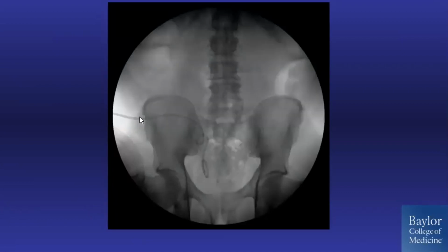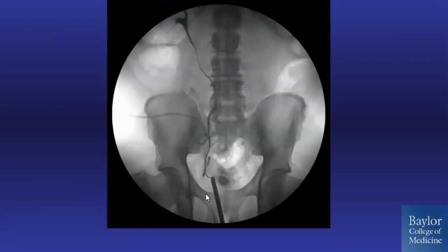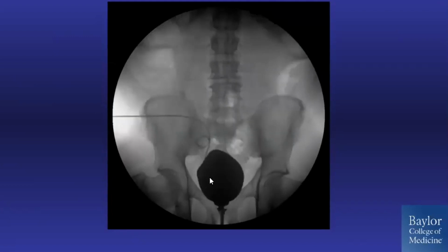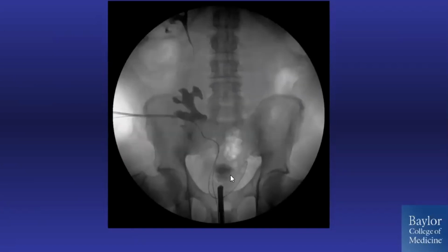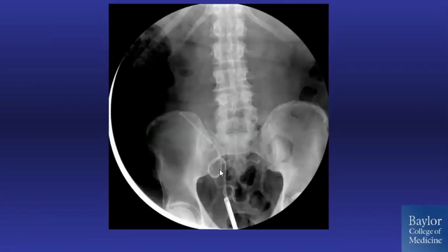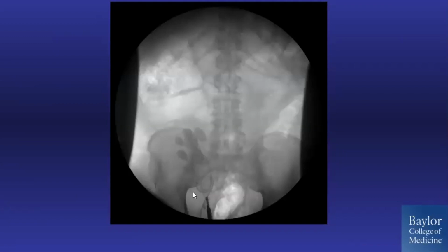And it becomes pretty clear here during our endoscopic workup when they've given us anterograde access. Here's me doing my typical endoscopic workup, getting my retrograde, planning out my reconstructive options. I'm going to grab the distal coil of the stent, externalize it and do a cystogram, just like we talked about before. But here, when I get my wires up and I start placing my stent, I don't know how well that reproduces, but there is a full 360 of the ureter in the middle of the ureter between the kidney and the bladder. Maybe you can see it a bit better here.